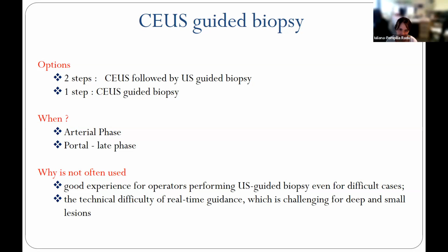However, this is very complicated because we have to know when, in the arterial or the portal phase, late phase, because you know that using the sound non-stop, you destroy the bubbles. So the process has to be super fast, and you have to perform the biopsy within 1 minute. And this is why we mostly use the portal phase.